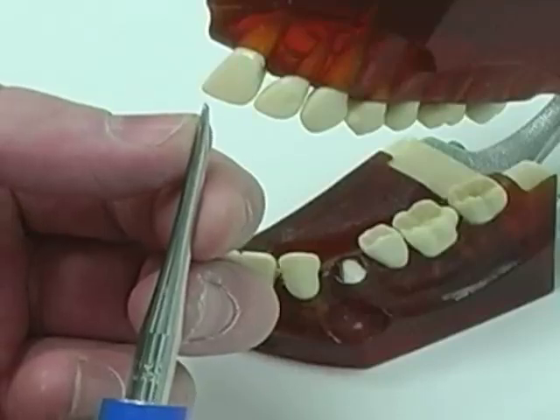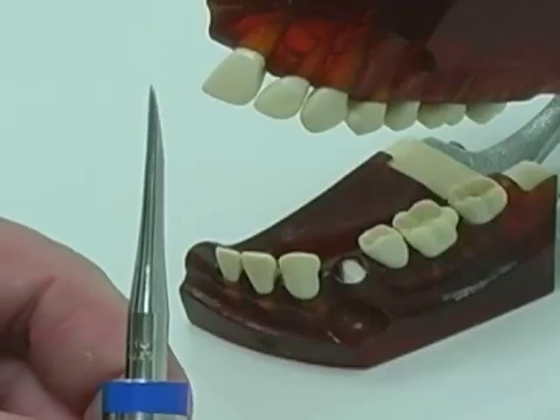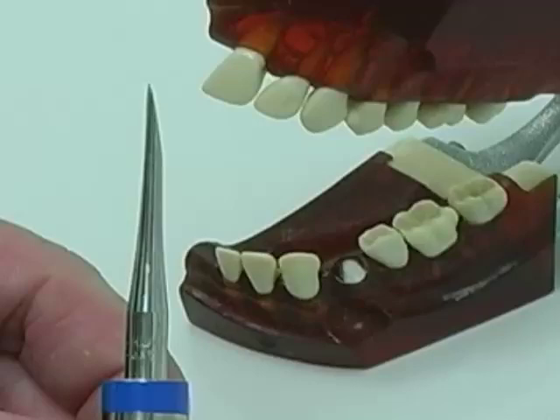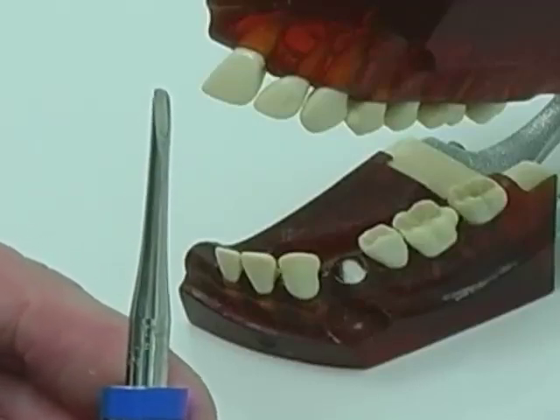We have four different kinds of these luxators. This one is a straight 3 mm luxator. There is also a curved 3 mm luxator, and a straight and curved 5 mm luxator.